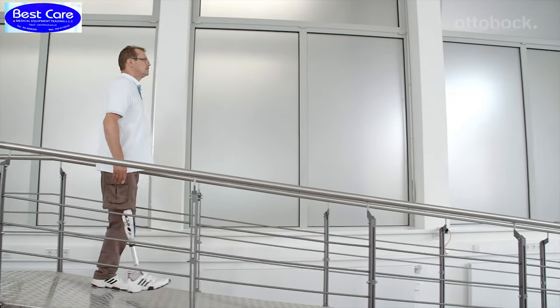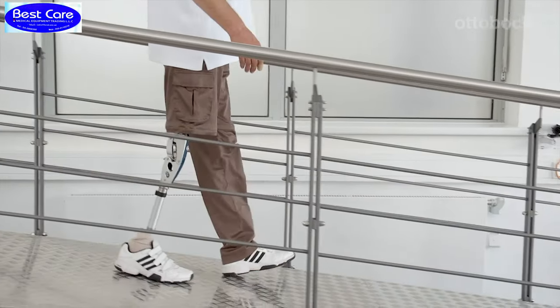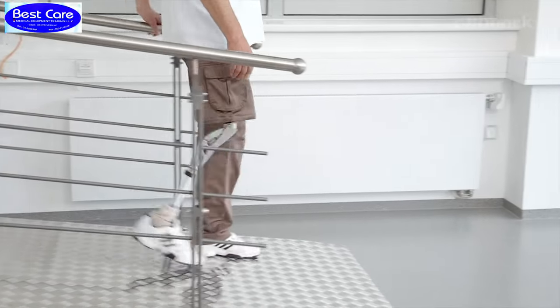Descending shallow slopes is possible with the 3R60 due to the 15 degrees stance phase flexion. In general, the steeper the ramp, the smaller the steps the user has to make.